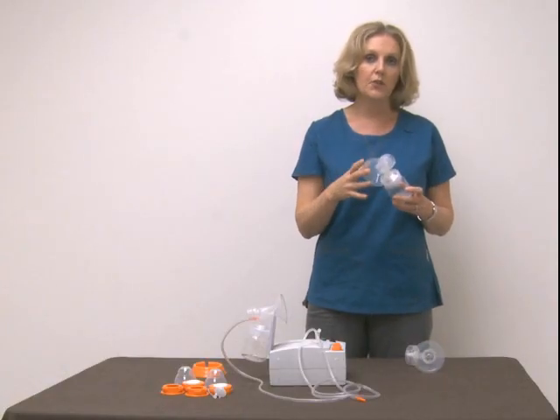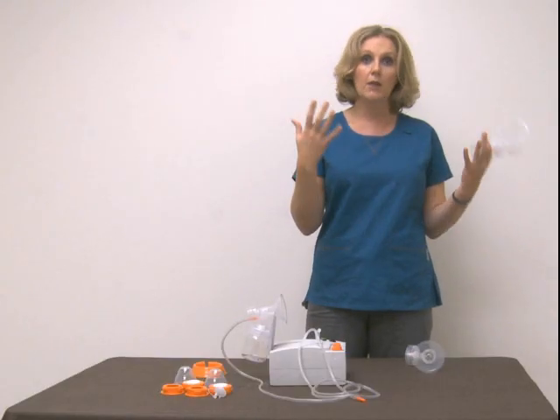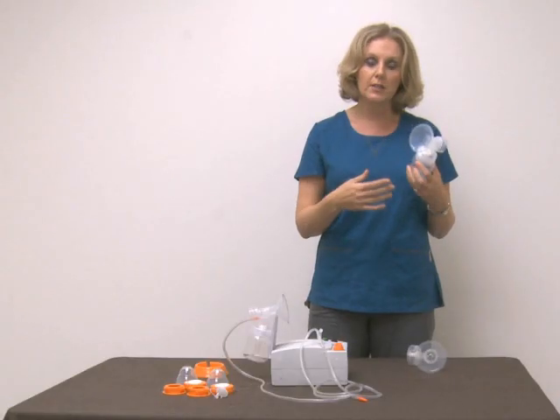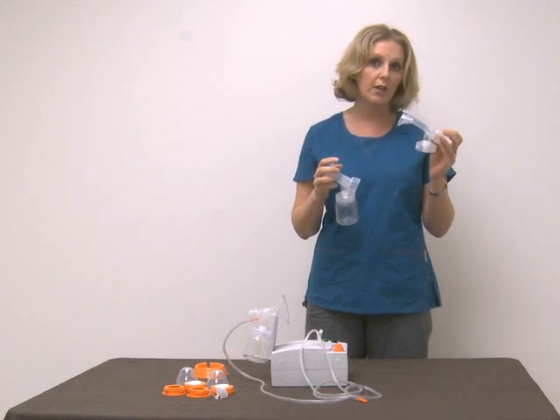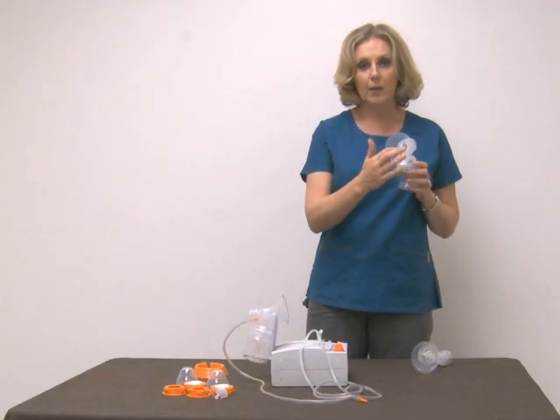Flange size — people often get confused because they think that if they're a large-breasted woman, they need a really large flange to match, but that's untrue. This is called a medium. I also have a large, and we have an extra large available through our website or any Hygieia dealer. Really, what it comes down to is a diameter — the diameter of the tunnel.